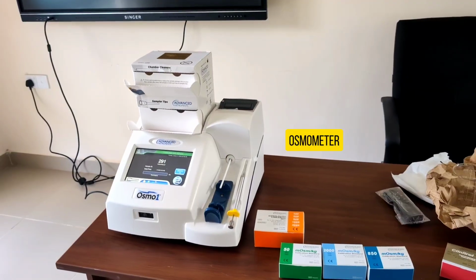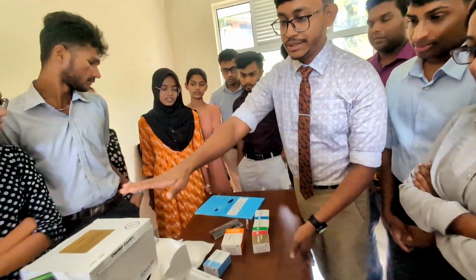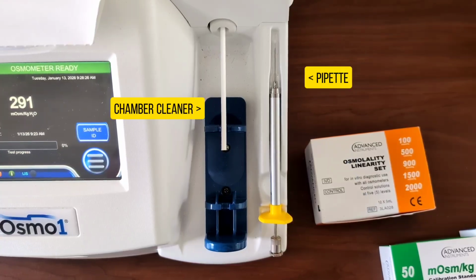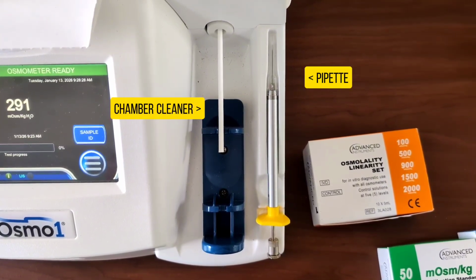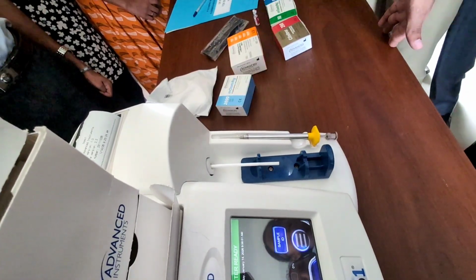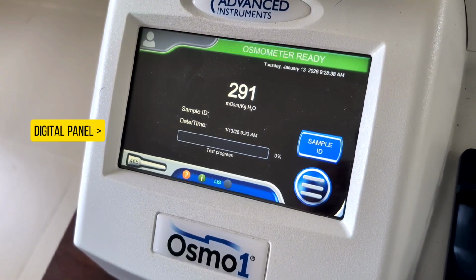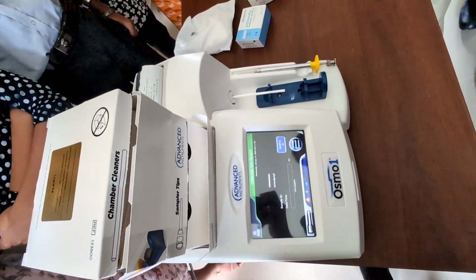So this is the osmometer. Let me explain what these things are. This is the chamber where the chamber cleaners are and the sample tips are, and this is the pipette from which we get the samples, and this is the chamber cleaner. It's supposed to be like this, like we have to insert it after every use. So this is basically the machine, and this is the digital panel where you get your results. It's a touch screen, so you can use it like that.